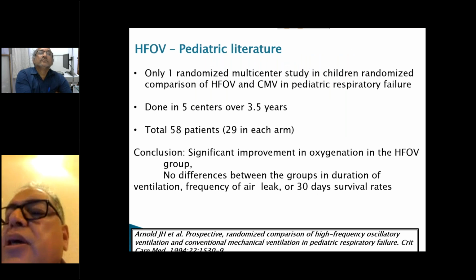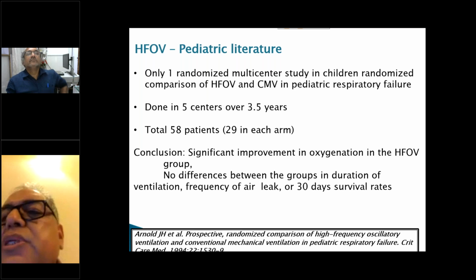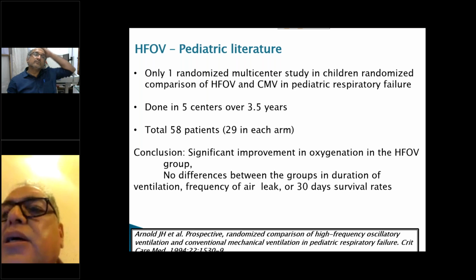Next. Pediatric literature is still open. As I said, the last word has not yet come, but there are many units where high frequency is used, and the success depends on the recognition and the time of action.